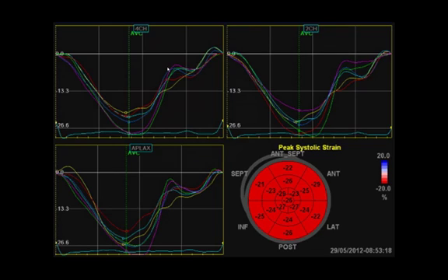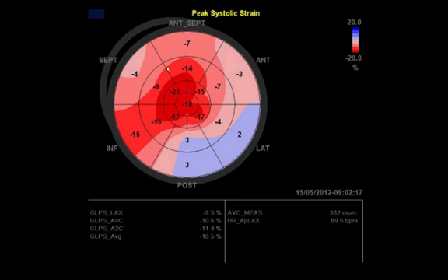I have seen that so well and clear in normal patients that we started to notice in other pathologies how important that gradient is. So, for example, in this case, I know that this is an abnormal one. Obviously, we don't see everything red in this bullseye map, but clearly we see that the apex is sort of preserved. It has very good numbers, and then the rest of the heart falls apart.